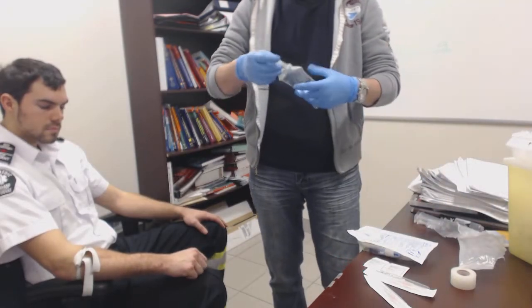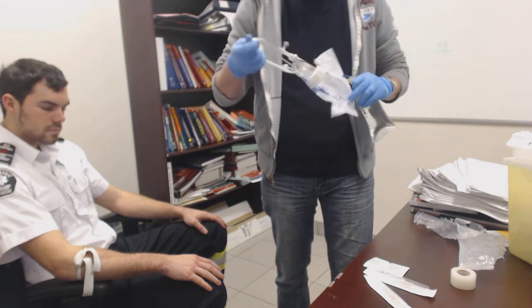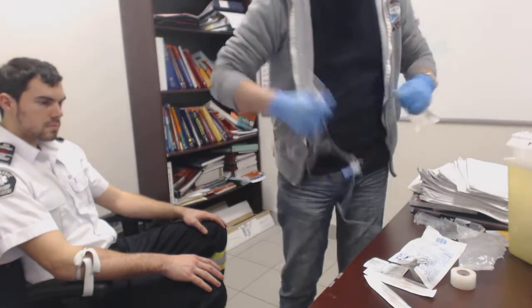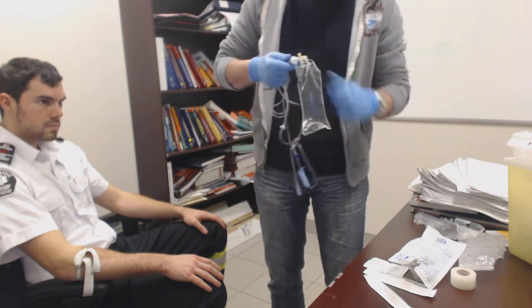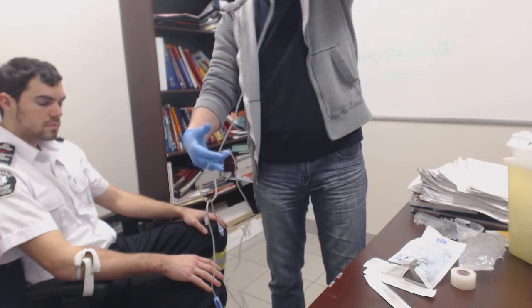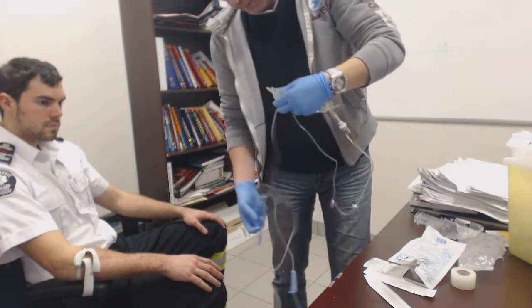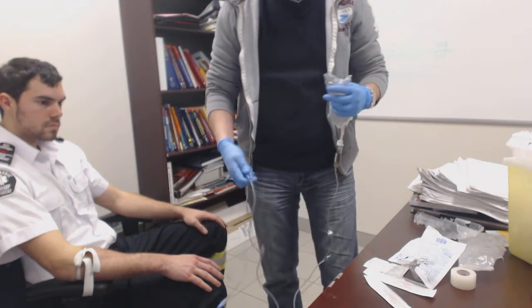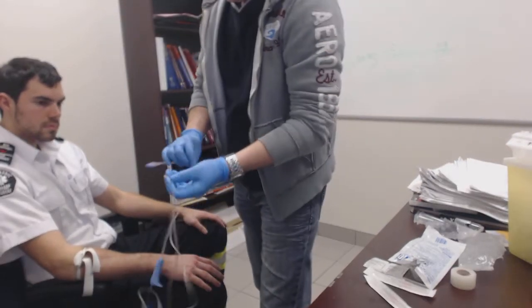Open my fluid, because there's no floaties in it. Open my drip set. It's important to remember that you don't need to clean your spikes before inserting it into the bag, as long as you don't touch it. Fill my drip chamber. And then make sure there's no air bubbles within the line. Use my roller clamp to shut it off and set it aside, as that is what I'll be starting into his arm.